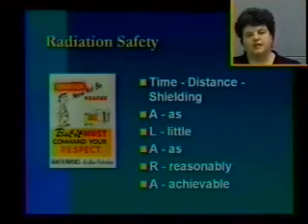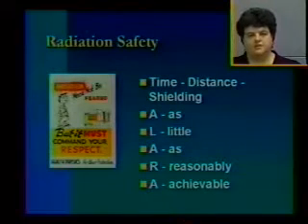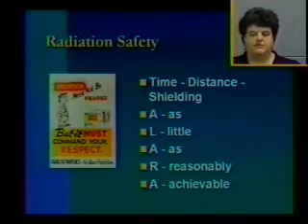And then shielding means wearing lead aprons, lead goggles, and gloves. Just a quick note on gloves. Gloves do not protect you from the primary beam. So if you are holding an animal and your gloved fingers are on the beam, you are actually receiving quite a dose to your fingers. Just something for everybody to remember.